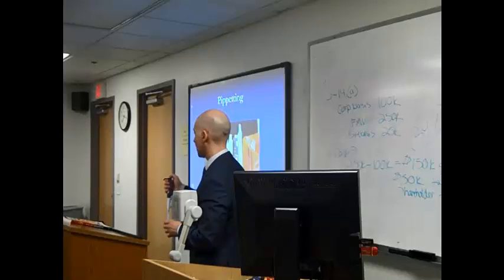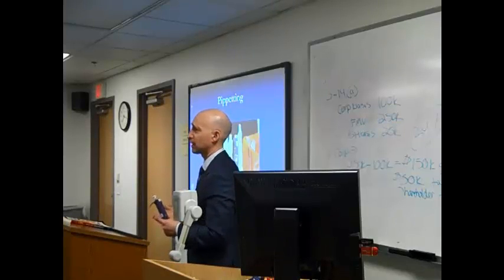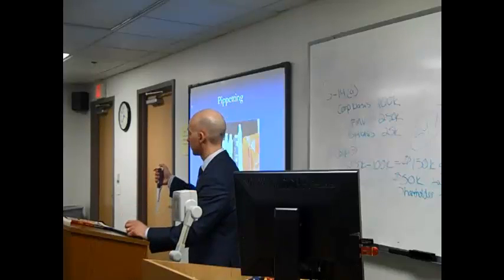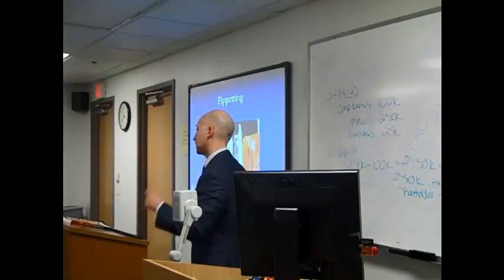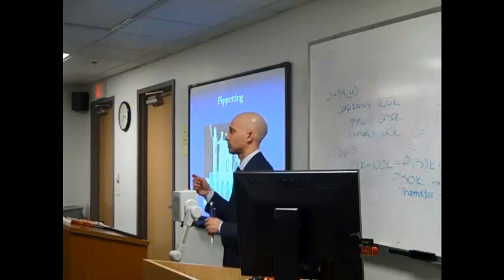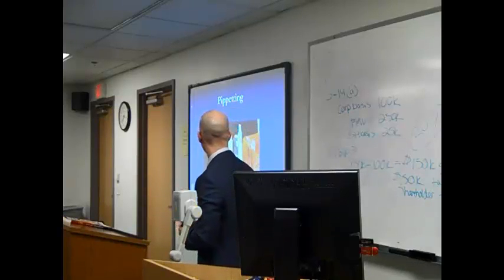Now, as you can see, there's 2 actions on this. It's down, and then you got to go further down. So if you're hand pipetting, that could be a good source of error, where they're not putting enough of the blood into it. And there's something called an internal standard, which we'll get into. And you have these auto pipettes, which essentially, they just push a button, and it just pumps the internal standard out.